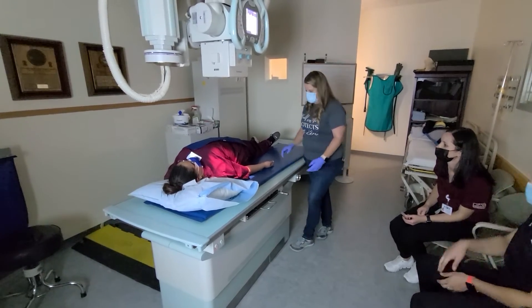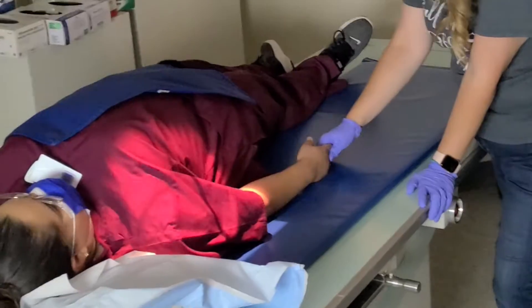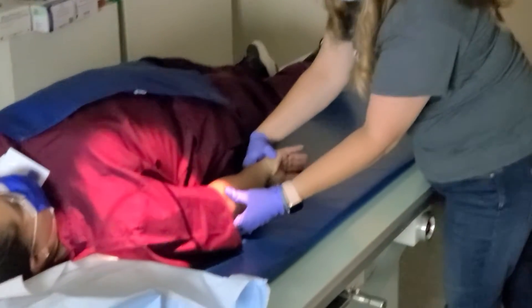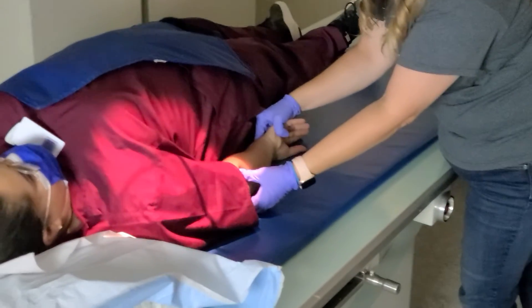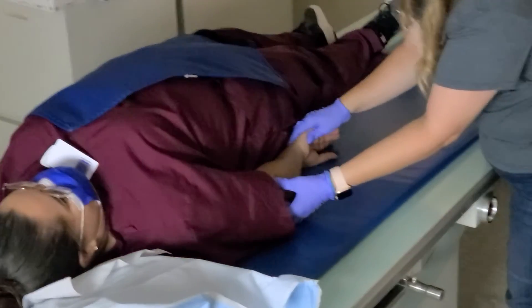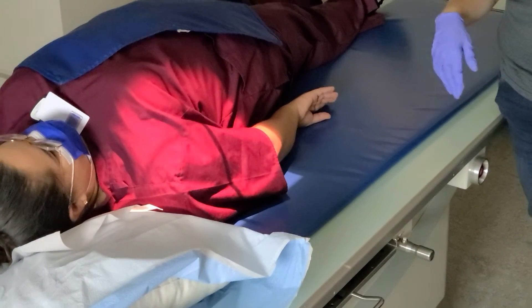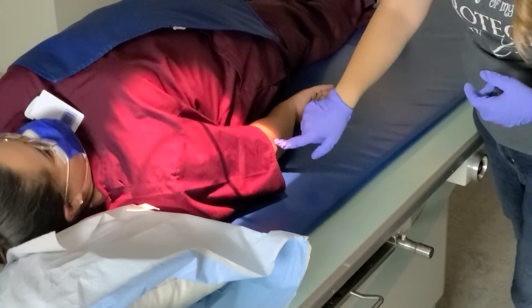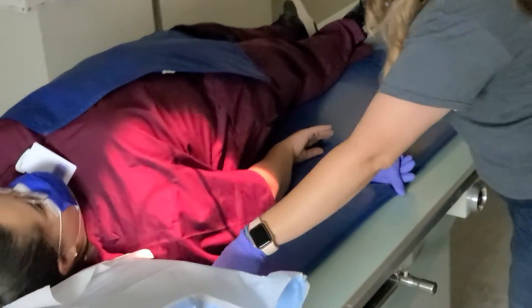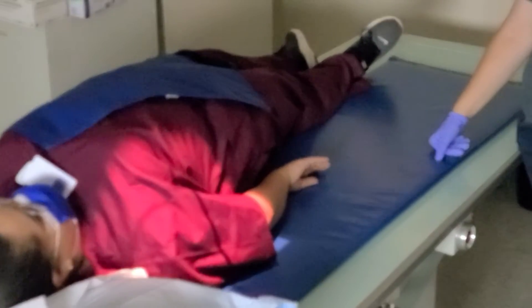For the lateral, you just take the hand and turn it palm in, palm down, thumb down. Now the epicondyles are perpendicular — it's very comfortable. Just watch because sometimes the arm drops a little bit when you do that, so make sure you still have the elbow in the field. She did pretty good there. Keep the same marker and use the same technique. Don't move, don't breathe, and click.